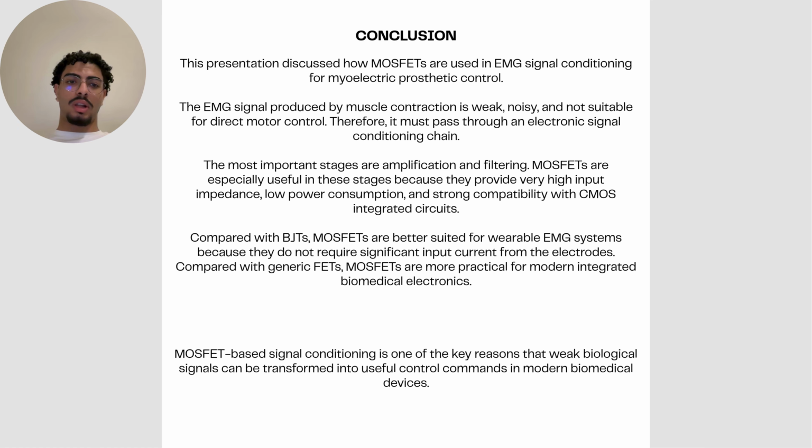MOSFET based circuits help solve this by amplifying and filtering the signal before it's processed by the microcontroller. MOSFETs are suitable because they have high input impedance, low power consumption, and strong compatibility with CMOS integrated circuits. Overall, MOSFET signal conditioning helps transform weak muscle activity into useful prosthetic control commands.